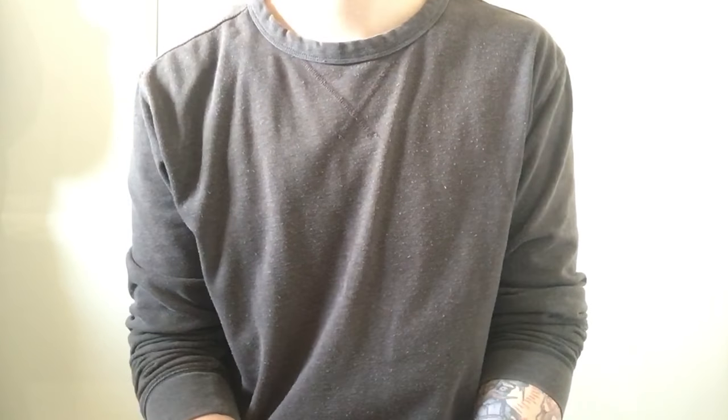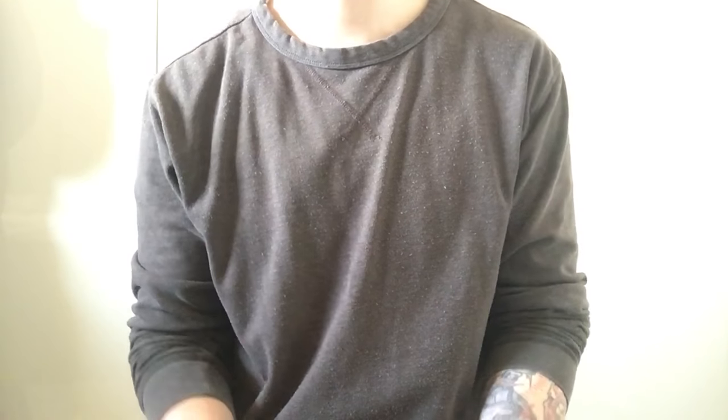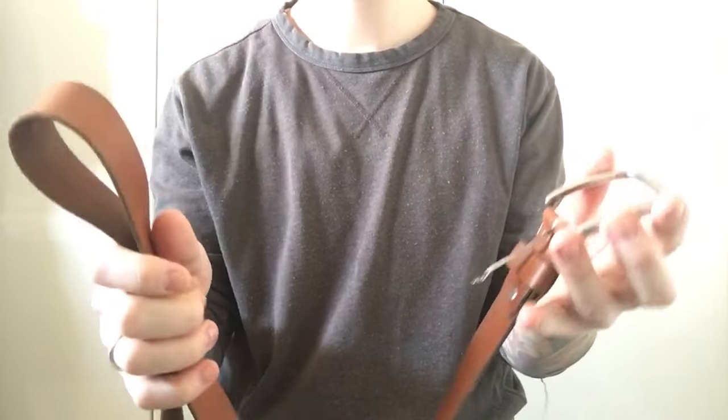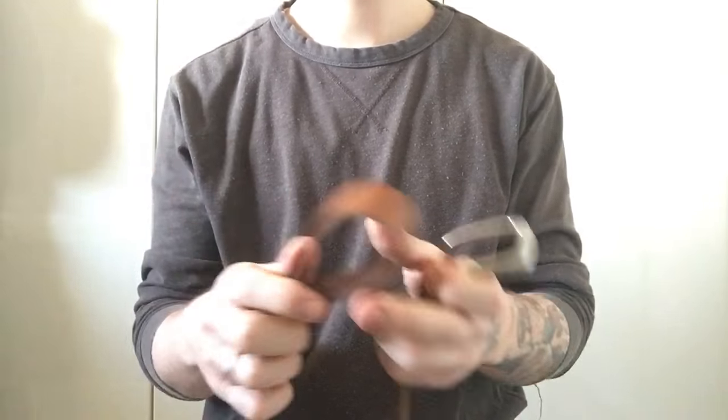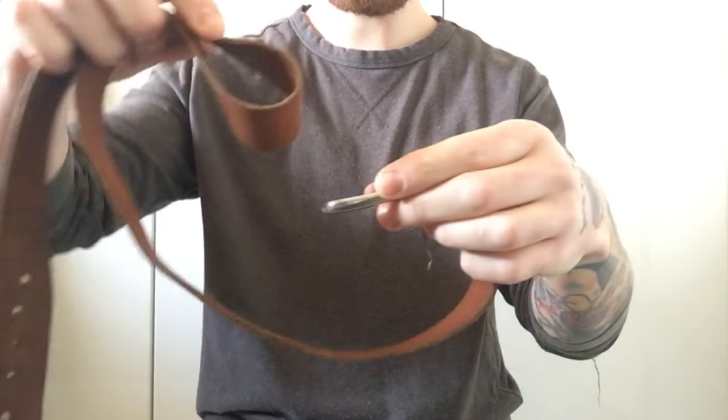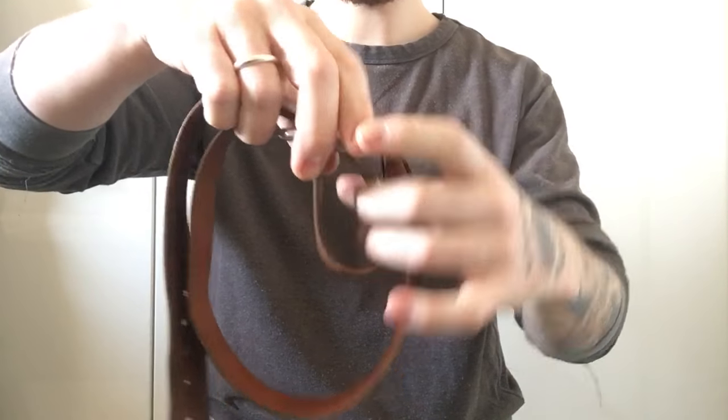Today I'll show you how to make an effective ratcheting tourniquet from a normal leather belt. Take your belt, make a loop, then pass the loop down through the buckle, so you have a double loop.